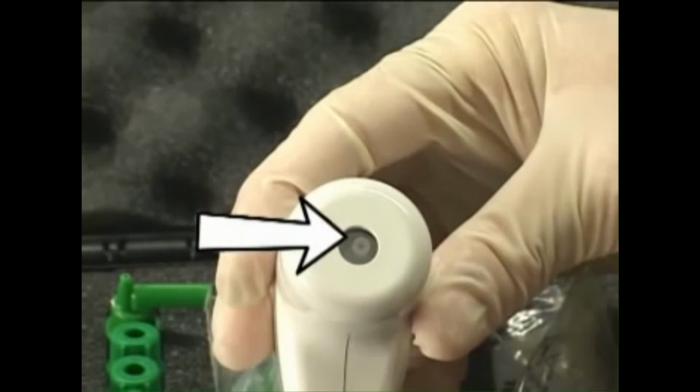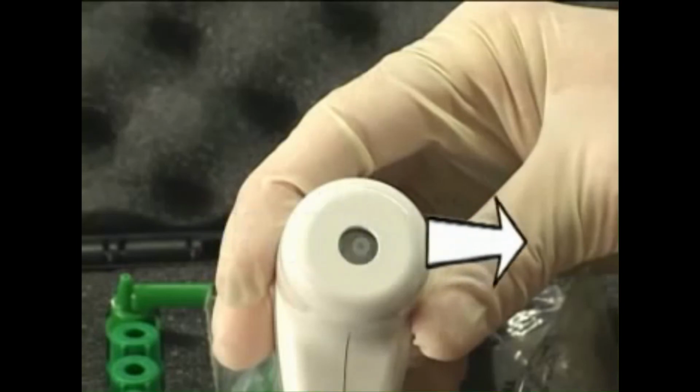This filter is located beneath the round screw-off cover. You should check the cleanliness of the disc filter before use. The filter is easily seen through the hole in the cover. If it is contaminated with blood, then you'll need to replace it before proceeding.